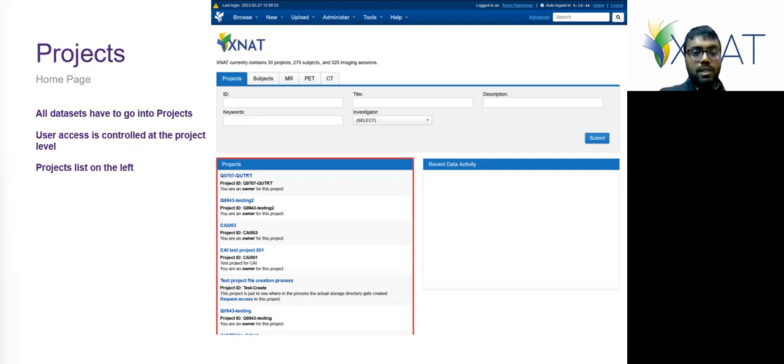I think we've got a question. I'll quickly address that. There are some issues with login errors the first time, even with the correct password. There are some causes of these kinds of problems, but if you have a login error, please send a support ticket because we'll be able to track it and see what's going on. And we do have logs that can show what happened.